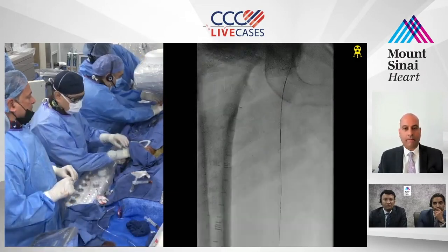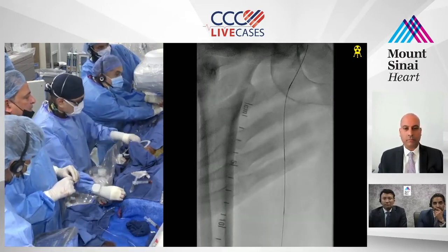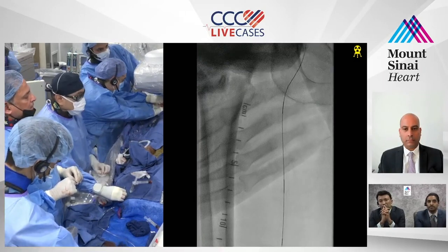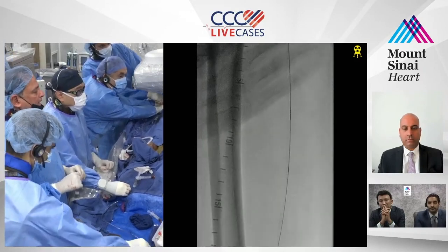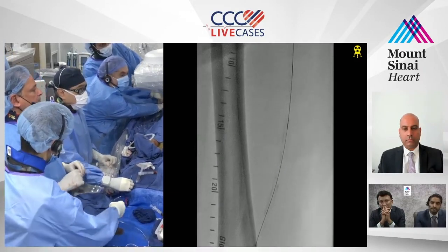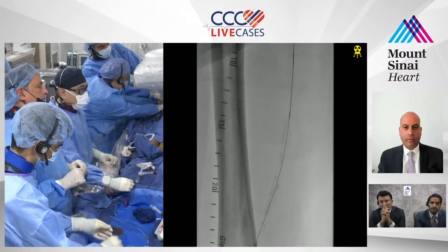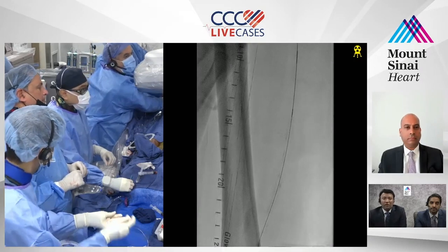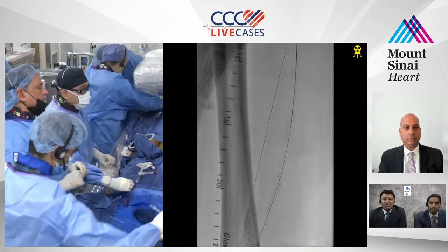Ray, can you fix the... Yeah, somebody just has to hold... Yeah, there it goes. There we go. I'm just trying to give extra support, the fat, that's what I'm saying. Excellent. This is the problem with sheathless. It's very difficult. Yeah, I agree with you. I know, but PK, why don't we put a pedal access sheath?